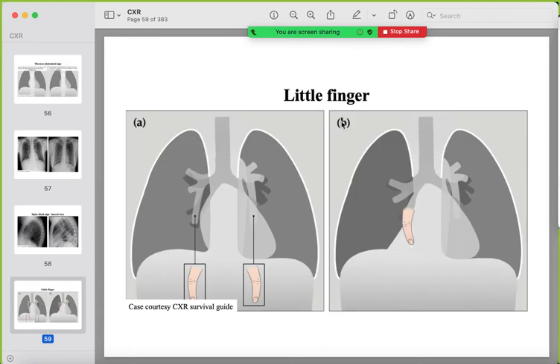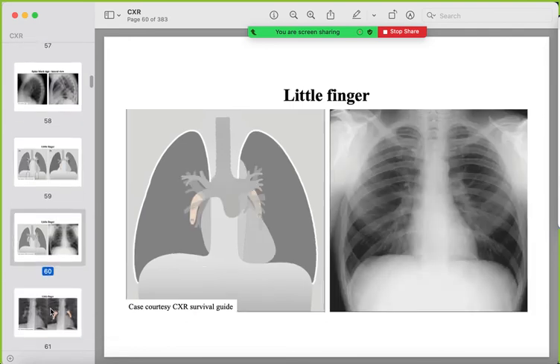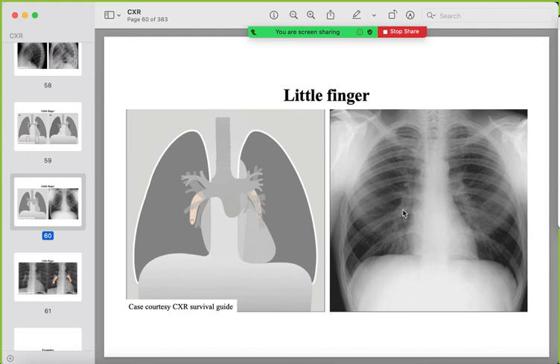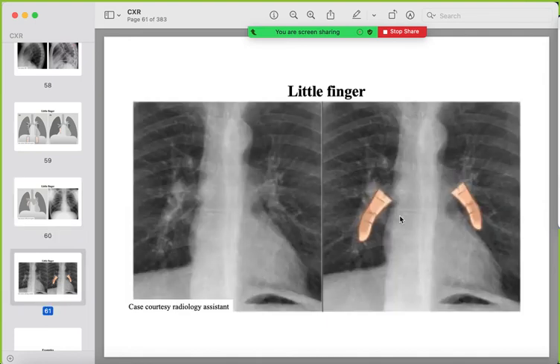The little finger sign refers to the inferior pulmonary vessels on the right and left sides — they should be clearly visible on the frontal radiograph. If they are lost, suspect abnormalities in the lower lobes of the lung.